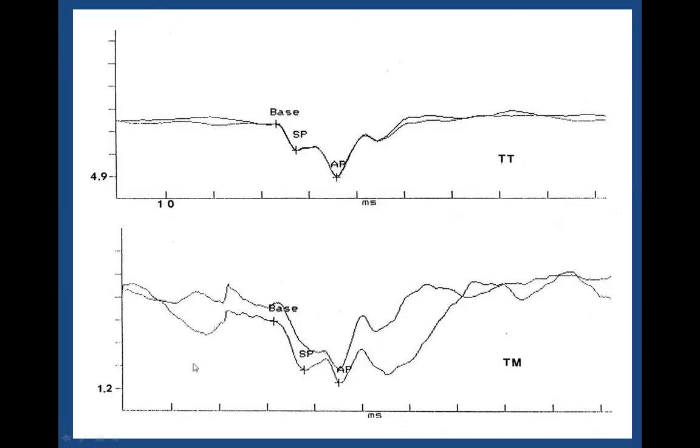But the important thing here is that the diagnostic feature of the electrocochleogram, the feature that leads to the interpretation of the electrocochleogram, certainly is preserved at the tympanic membrane, and we found this to be the case with tone bursts, et cetera. And so from our perspective, there really is no need to do transtympanic recordings.